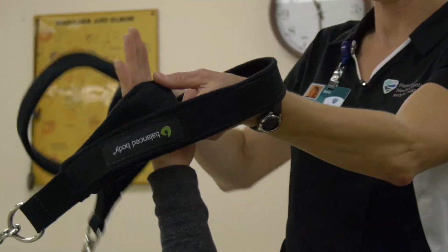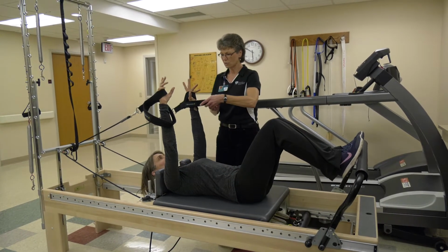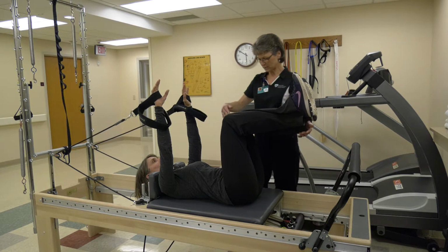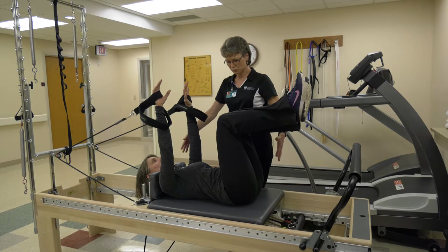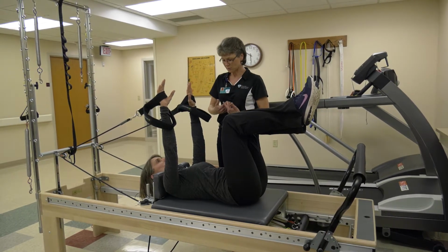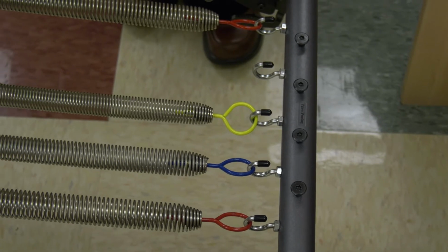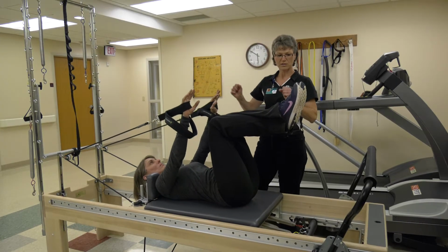We'll go ahead and bring your hand right there, some straps, which can also be used for your feet. And to challenge her, we're just going to have her legs just like this for demonstration. And she really holds her trunk nice and still. And then we work on breathing. So you're going to breathe in and breathe out and bring your hands down by your side. And you can see how the springs are being used as a resistance. And you're going to breathe in, coming back, and everything's very controlled.